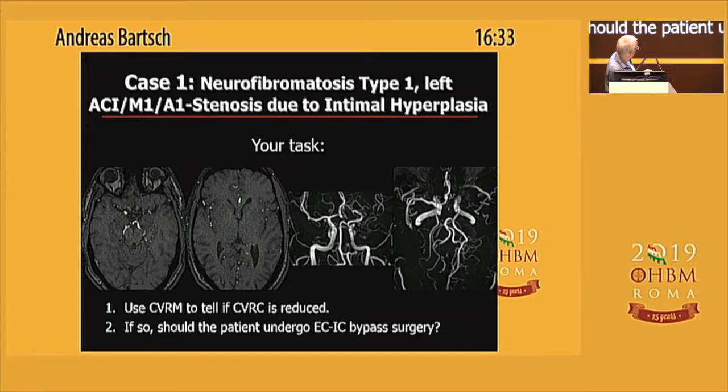That's not okay here. You also see that the patient has, what Natalie mentioned, a fetal variant of the posterior cerebral artery here. So we don't expect any, and that's not included in the stenosis. We don't expect any perfusion abnormality in the territory of the posterior cerebral artery.